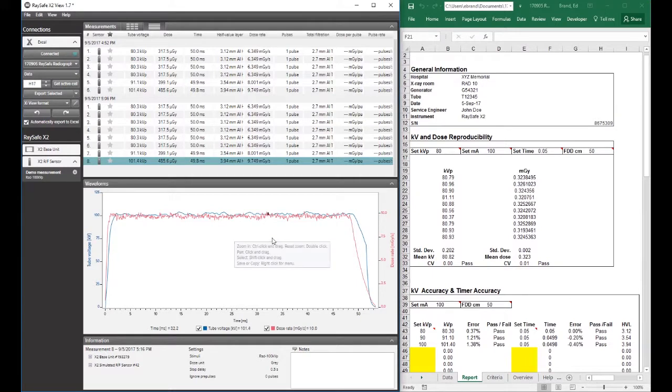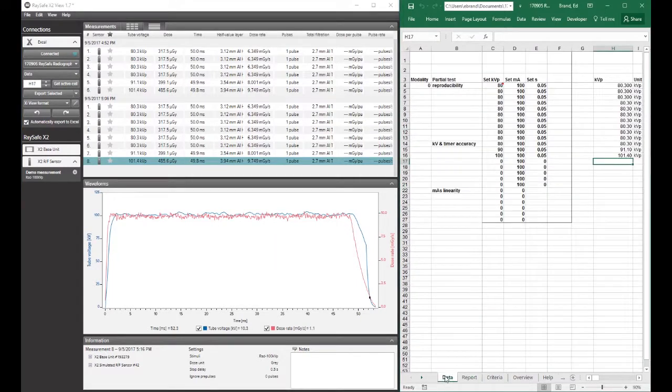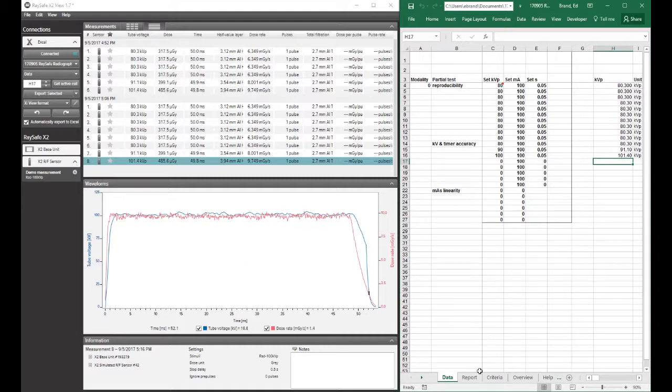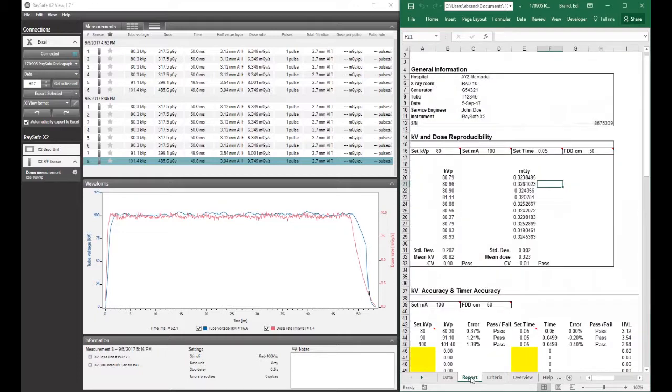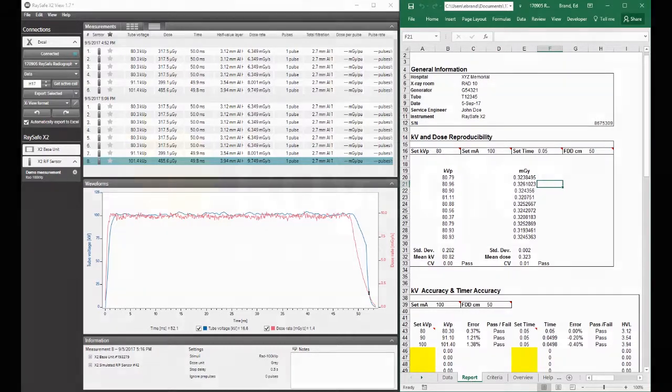Or just make some exposures, making sure that this box is checked. And that data then, remember to make sure you select the correct starting cell. That data from the exposures will populate the report, and then you'll have a nice looking report that you can print. All right, thank you.